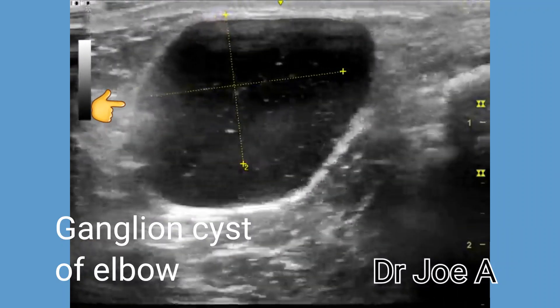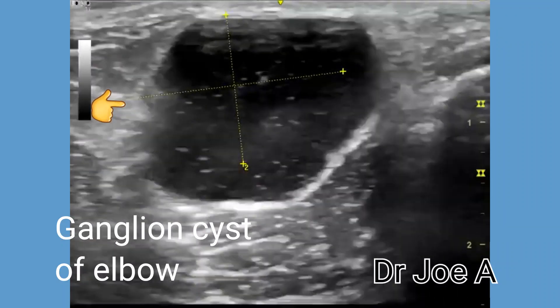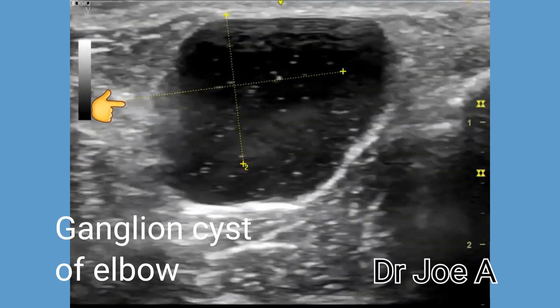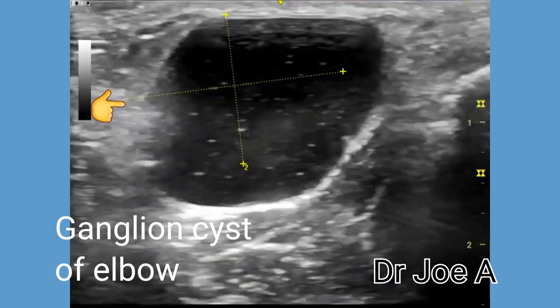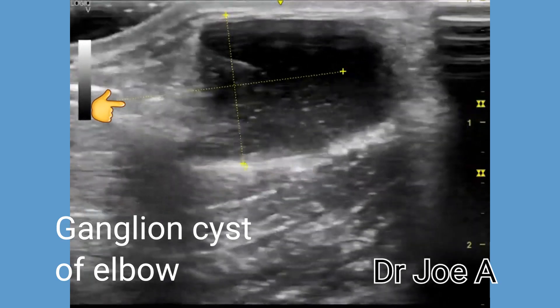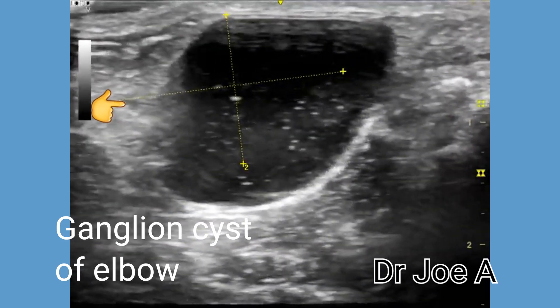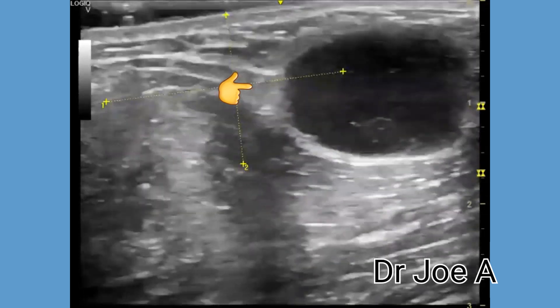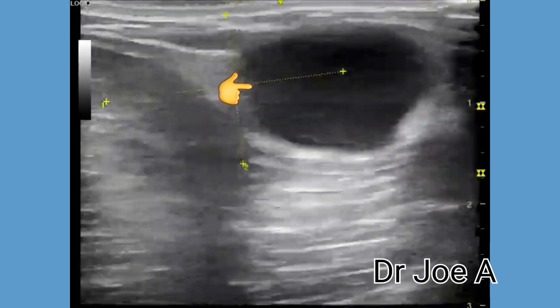This patient has a ganglion cyst of the lateral aspect of the elbow. A ganglion cyst is a common benign growth that is cystic and appears on the wrist of the hand, but can also occur in other parts of the body, including the lateral aspect of the elbow.